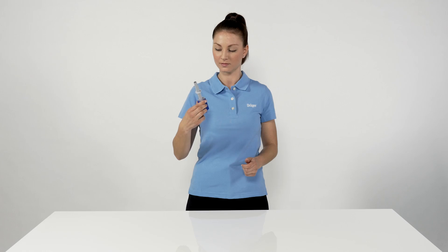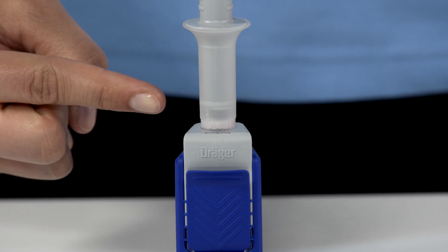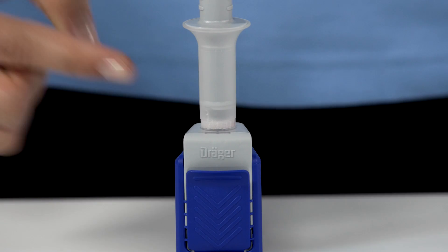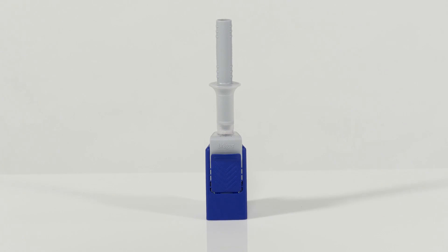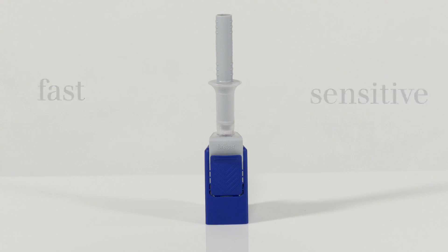Hold the test kit upright or stand it on an even surface. As you can see, the red indicator ring has discoloured. The Draeger DrugCheck 3000 enables you to choose between a fast or sensitive measurement to prove the presence of THC.